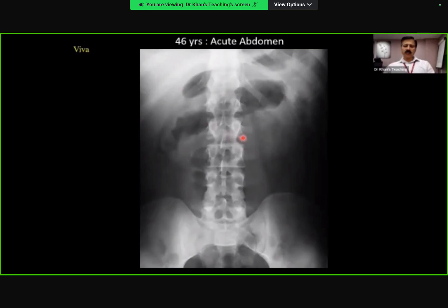If you see here, the normal transverse colon has haustra, and this should be in your mind, in your description in the exam. Loss of haustra. Remember that. The loss of haustra. Number two, if you see, these are thumbprints, right? Lots of haustral loss, there is thumbprinting here, and maybe a pseudopolyp.